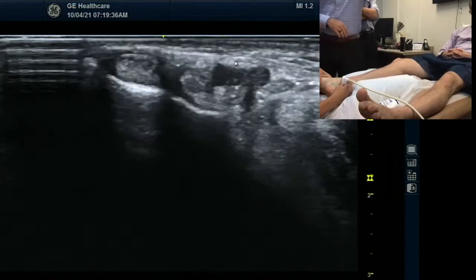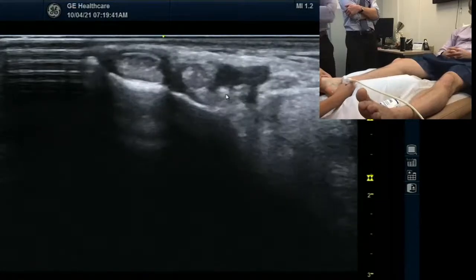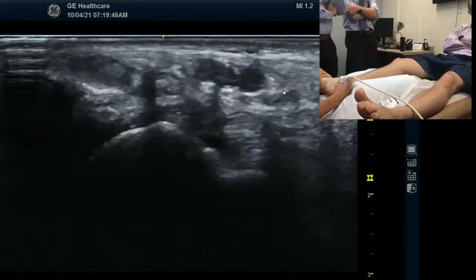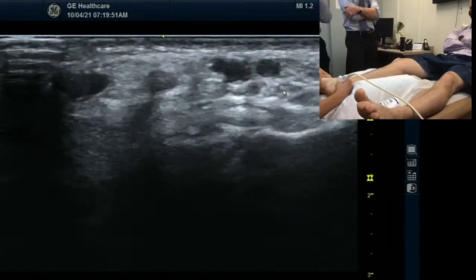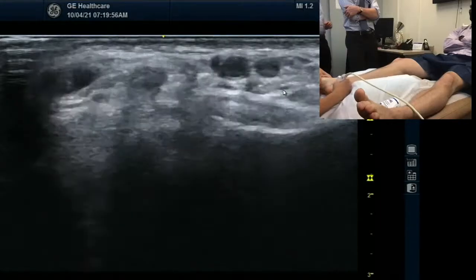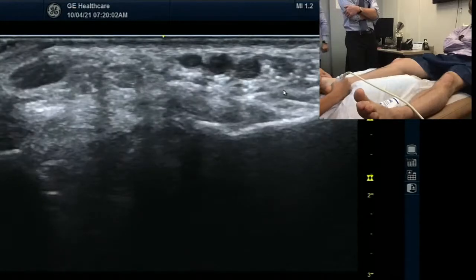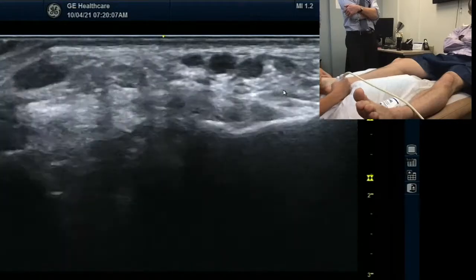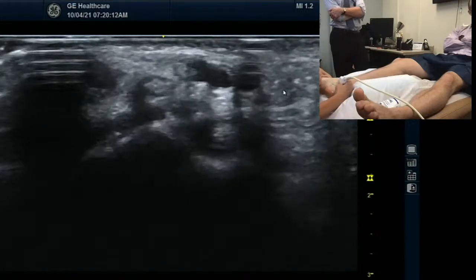That's what I wanted to look at. Artery vein nerve. But from here it's very hard. He's getting sonopalpation right now. So I can freeze? Oh, I can see here. Do it again. Make it as a honeycomb. I'll go back to superior to get that honeycomb again. That's definitely honeycomb. Nice. Good. From here it's very hard. Yeah, it's clear from out of here though. Now you can see it.